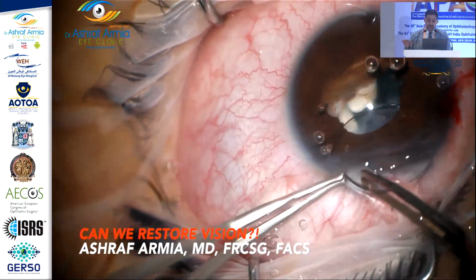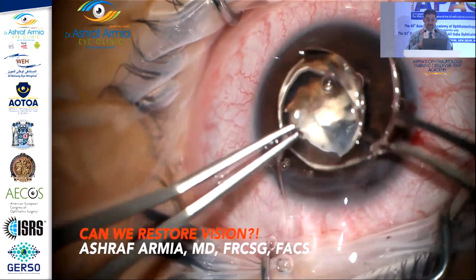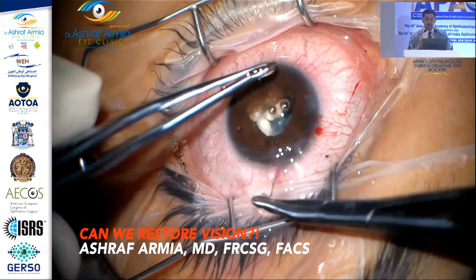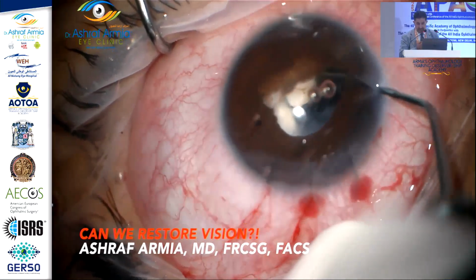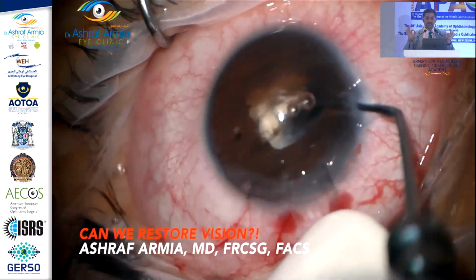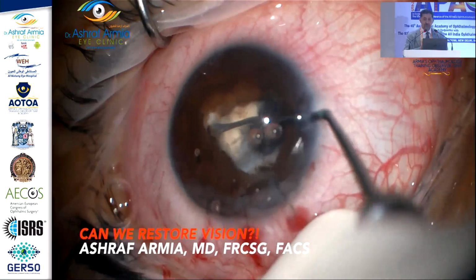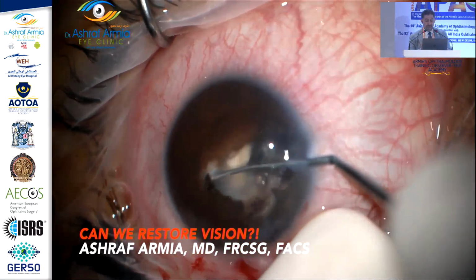So the first challenge was done, removing this PMMA with the least trauma. But there is a huge, and I discovered that the broken haptic was the cause for capture of the IOL. Viscoelastic, I closed the anterior chamber because manipulating the eye in a closed anterior chamber is safer for the eye. Then I'm trying to find a way or a space between this adhesion between the iris tissue and what's behind.